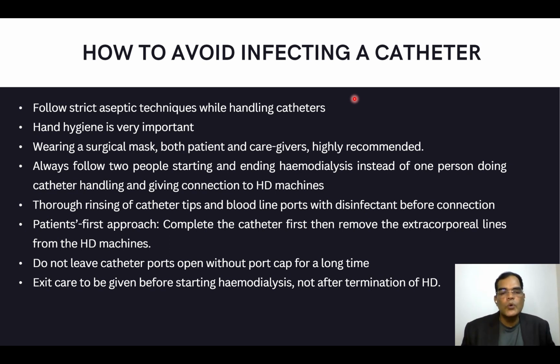Always have two people for starting and ending the procedure, because sometimes one person will be handling both: catheter care, meaning opening the catheter, cleaning the area, putting on the dressing, then aspirating the catheter, flushing the catheter to see the patency, and after that giving the connection. So with one person, there is a chance of compromise and contamination.